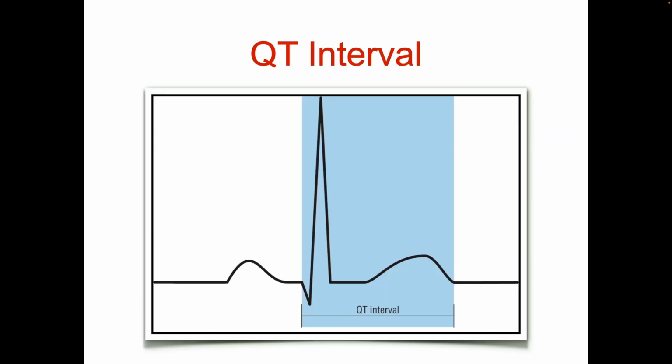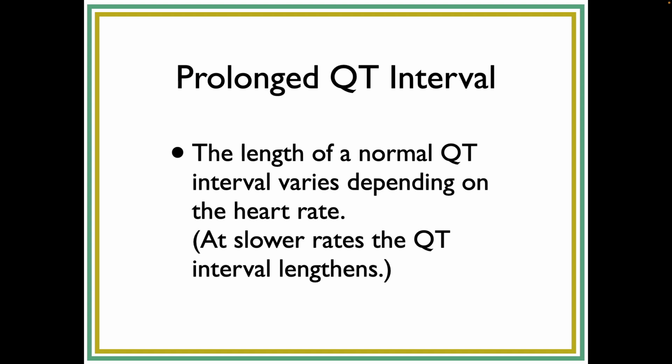Okay, so reminder, here's the QT interval from the start of the QRS to the end of the T wave. We did this earlier in the term. So for a prolonged QT interval, the length of a normal QT interval depends on the heart rate, okay?